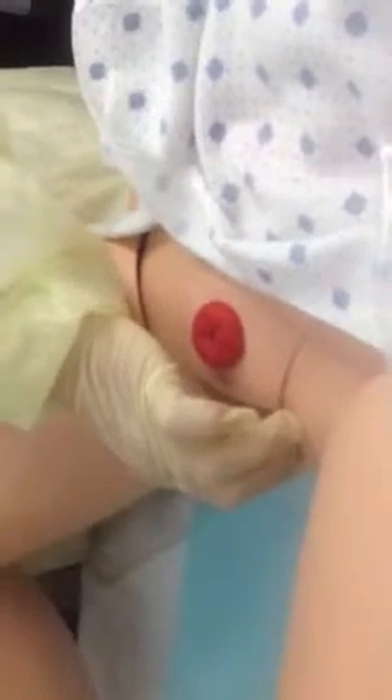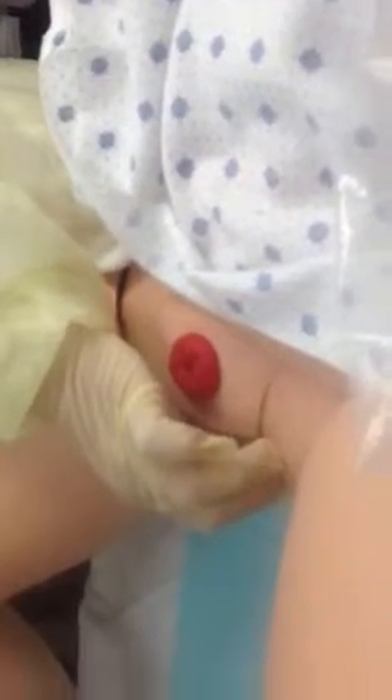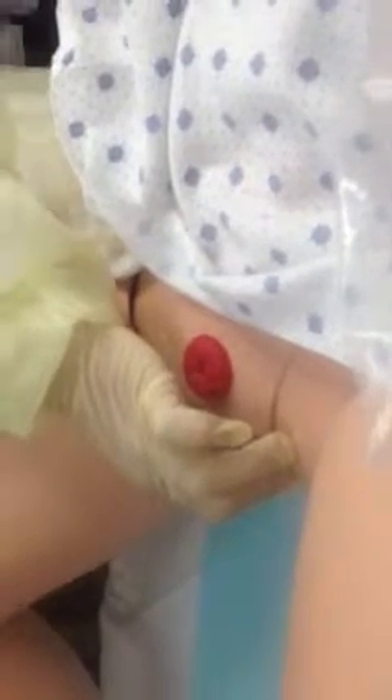So I spread the labia. I've got this with my betadine on it. I'm spreading the labia, and I'm going to pick up a cotton ball and go down one side and clean it. I'm going to take it and drop it there. You just go down and clean the labia, because that's not going to stay sterile. You want to make this area right here, where you're going with that sterile catheter, as clean as you can make it. And remember, you've already washed it some, and so then you take another one, go down the other side.